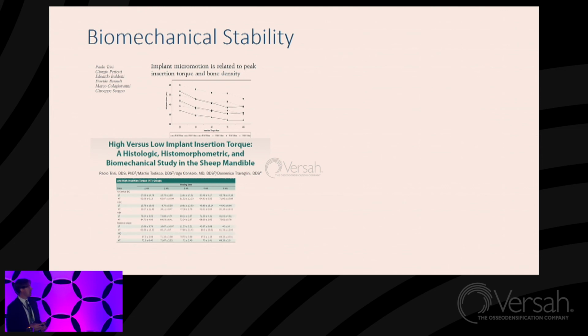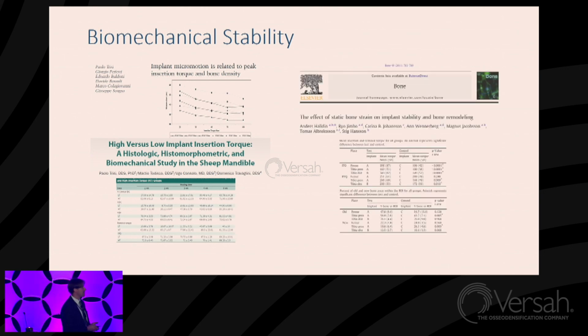So Dr. Trissy is going to talk extensively about his research and his current work with osseodensification. But I just also want to point out how the increased density and primary stability that we see in our study is related to the amount of micromotion that we would expect to occur, and how that we expect will impact the healing response. So we expect to see improvements in the healing response, even though in our study, we just looked at the day 0 response.